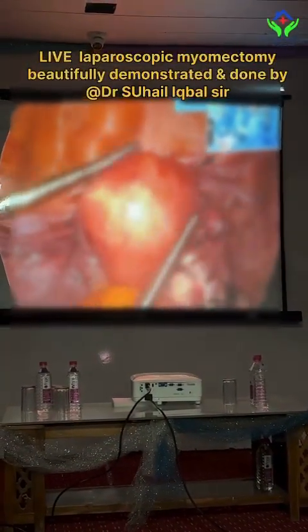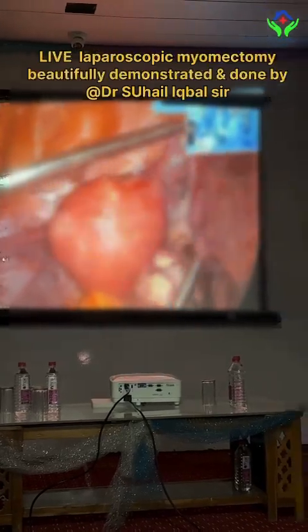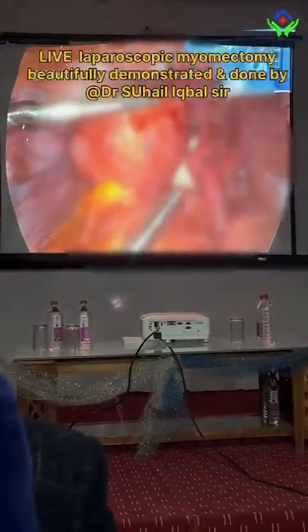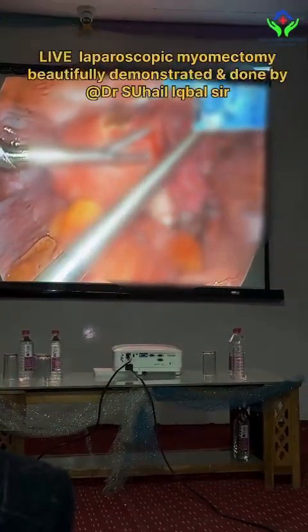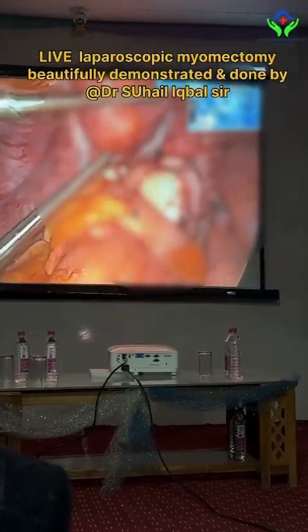Okay. I think this could be caused by these multiple fibroids, I could see. This could be the cause. Uterine distortion, architecture is disturbed. But the fallopian junction, tubal junction looks okay outside. I think you need to go for a hysteroscopy also. Yes, sir. Definitely, I will go for hysteroscopy.